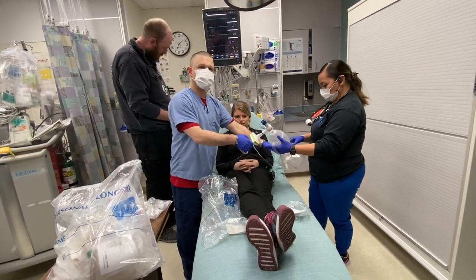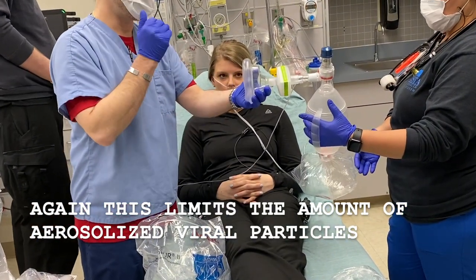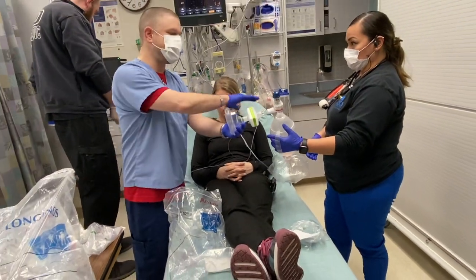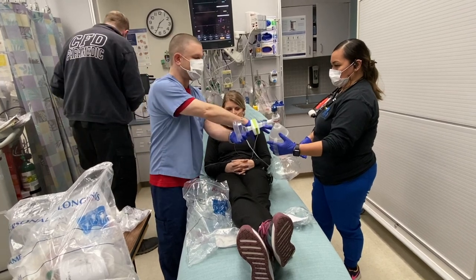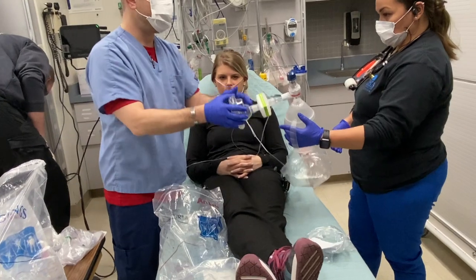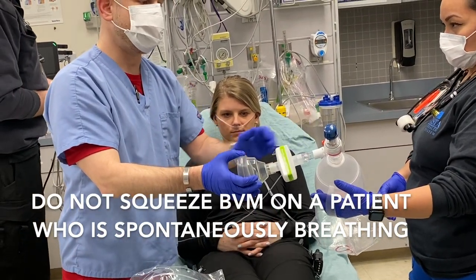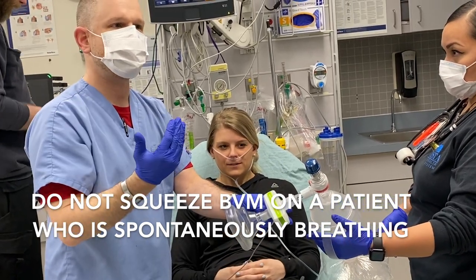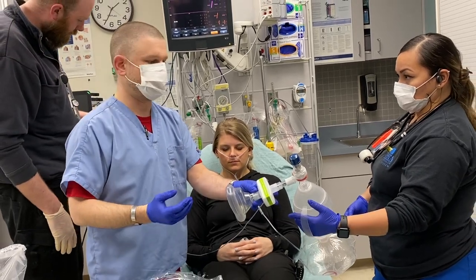Okay, so now you have to understand that the oxygen in this reservoir has nothing to do with this mask until the patient takes a breath. The patient's spontaneously breathing, so it's important not to squeeze the bag. The patient will pull the oxygen from this reservoir into his or her lungs without squeezing the bag. So do not squeeze the bag, okay? And the purpose of this whole device is to provide CPAP without the risk of aerosolized particles, okay?